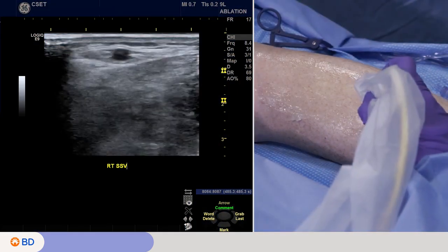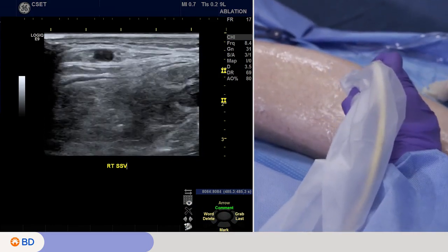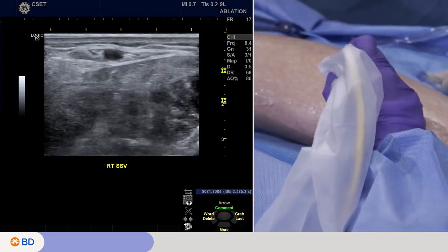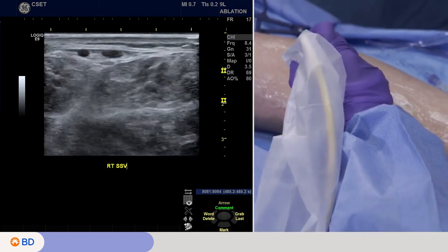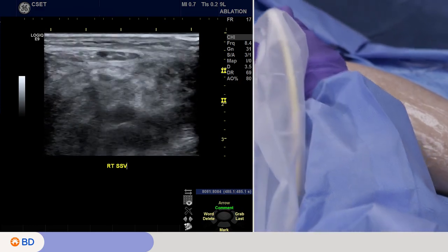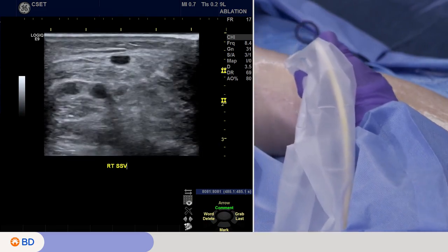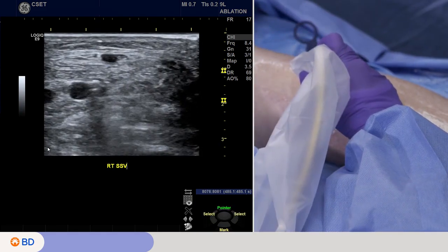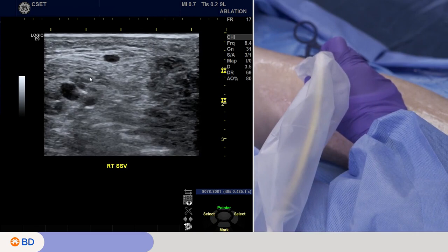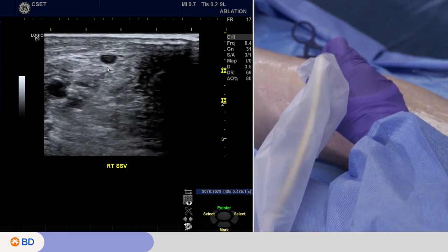One of the most important things we do after we prep a patient is we tour through the anatomy with the ultrasound for several reasons. One is to identify the course of the vein to see if there are any anatomic variants, but also to see if there's any interval changes from our diagnostic ultrasound. As you can see on the ultrasound, it's very straightforward. There's a small saphenous vein in the center of the screen. It's encompassed by fascia, the superficial and deep fascia. It has that classic Cleopatra's eye appearance that Casey's showing you. And this is the small saphenous.